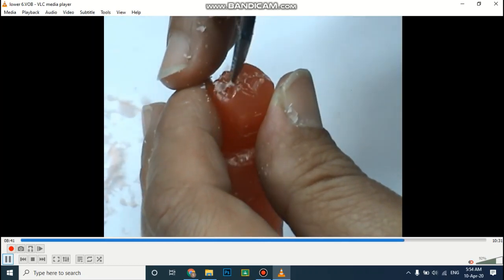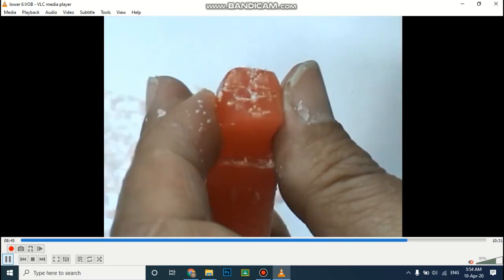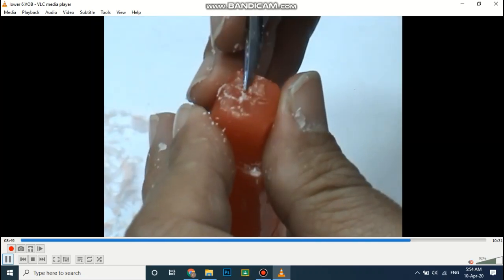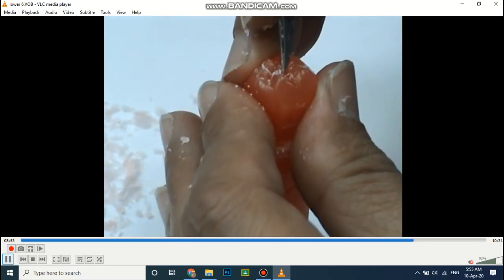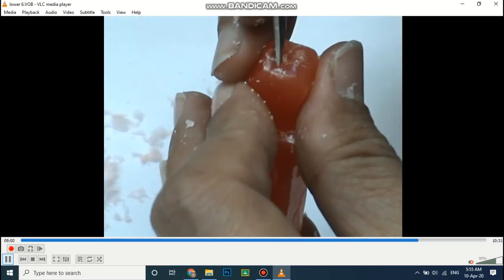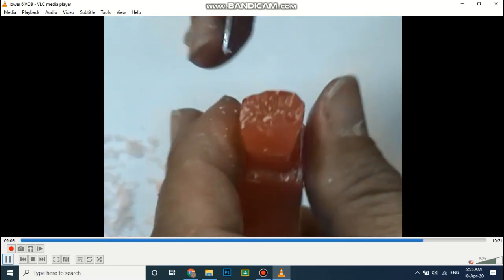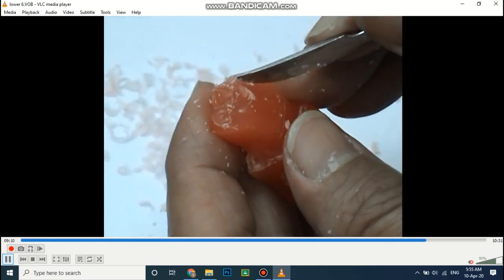From each groove, we flare from the groove to the triangular ridge, accentuating it, removing extra wax, and communicating all the grooves together, and the central fossa is now created with the developmental grooves, mesiobuccal and distobuccal and lingual groove.